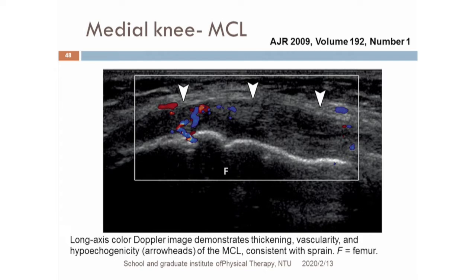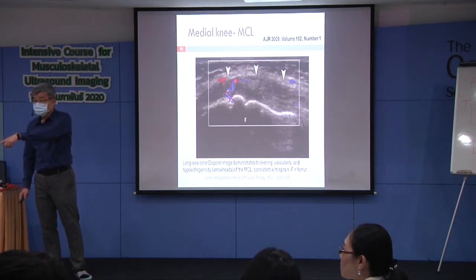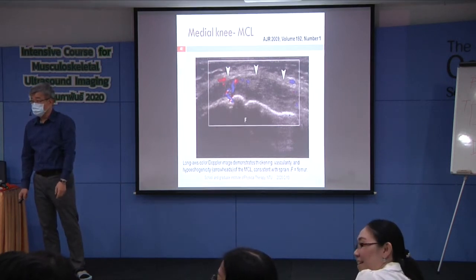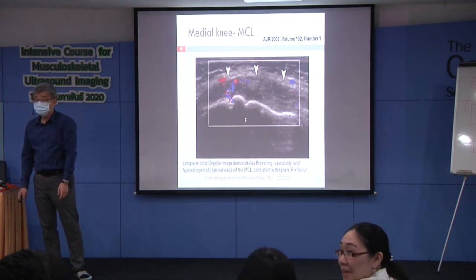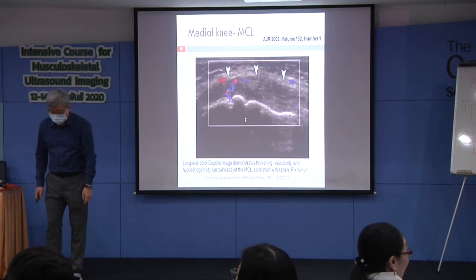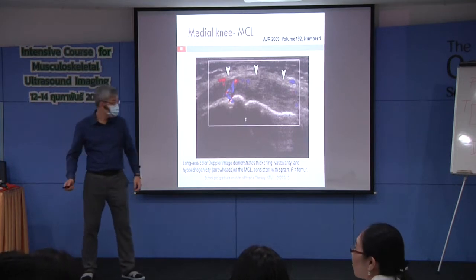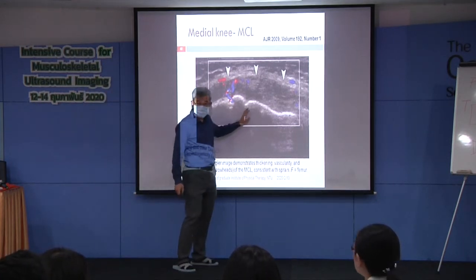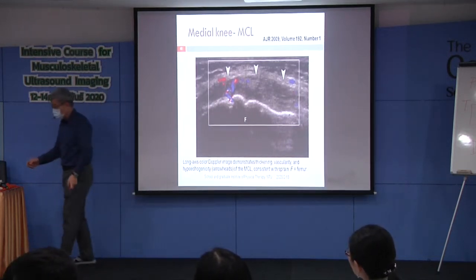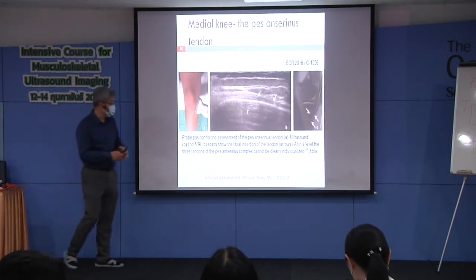So a lady at this desk has recurrent knee injury, right? Or that table, a lady with atrophy of the medialis. Oh, a guy, sorry, it's my fault. So there is some cortical irregularity. Okay, you can look at his knee. The pes anserinus is not difficult.